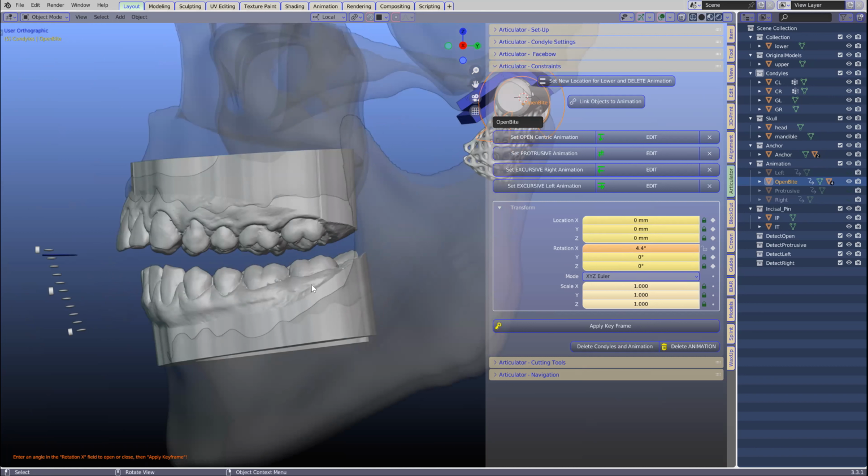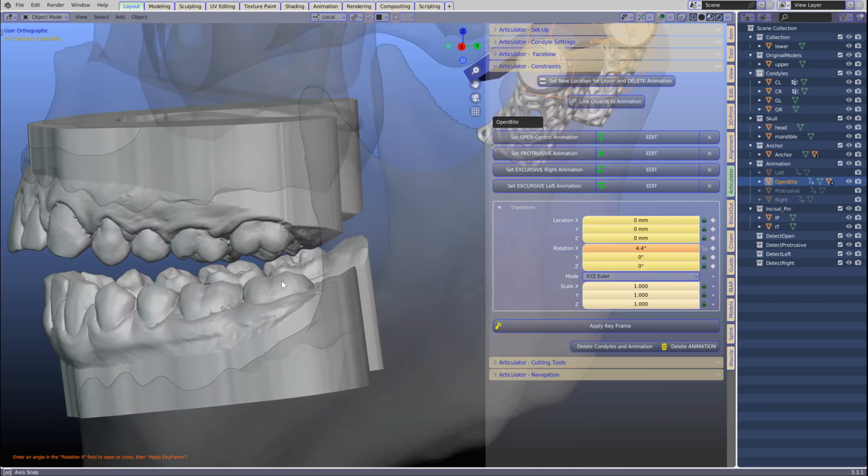It's tricky from an individual basis because you may have a person with an overerupted tooth or something. So we are looking at this from the back because you need enough space, and correctly so, 3 millimeters is usually quite a good opening.